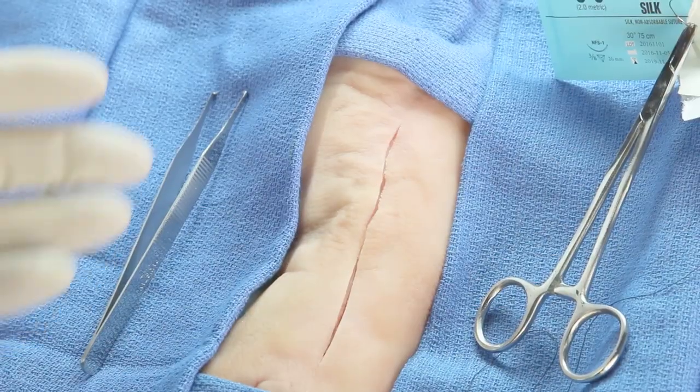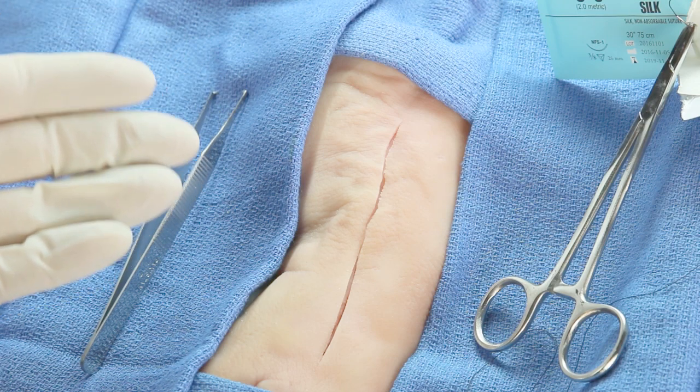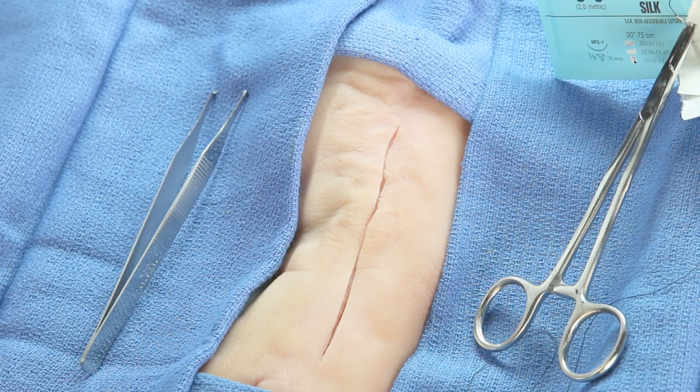Notice that I'm not wearing scrubs, because the chances are that you, survival medic, won't be either, as you're faced with injuries and illness in long-term disasters. Wash your hands and let's go. First, I want you to take a look at this laceration I've made on my 95-year-old grandmother — just kidding, this is a pig's foot, an excellent tissue on which to learn suturing.